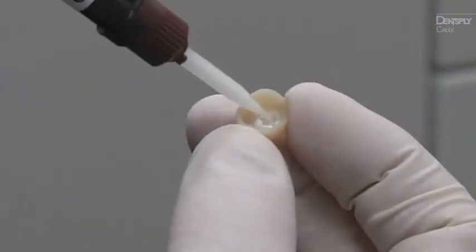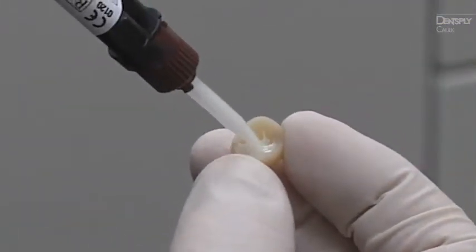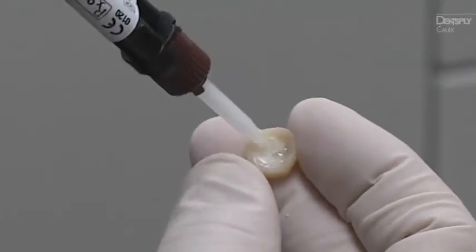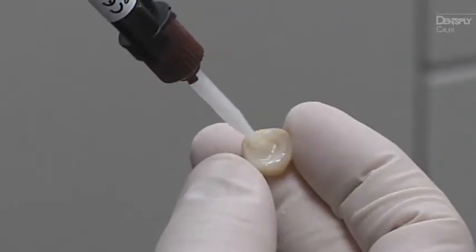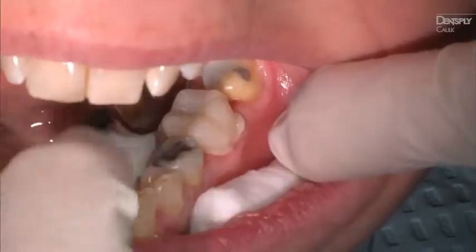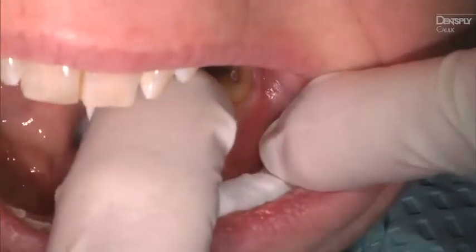Apply a thin, uniform layer of Calibra Universal Cement to the entire internal surface of the restoration. No additional bonding agent is necessary. Next, seat the restoration. Be sure to protect the restoration from contamination and movement until the final set of the cement.